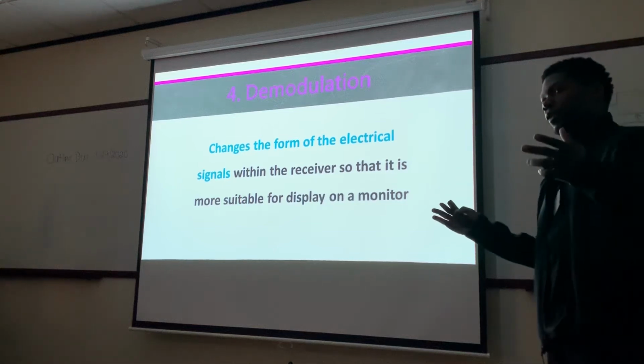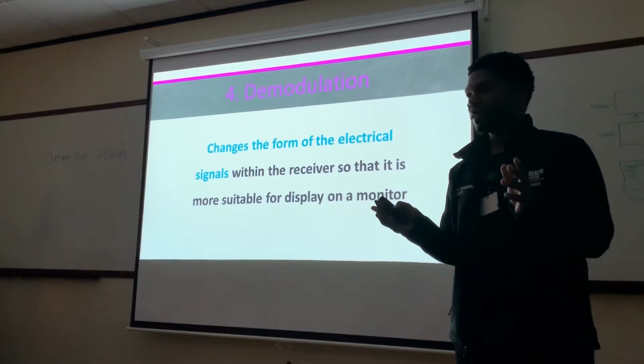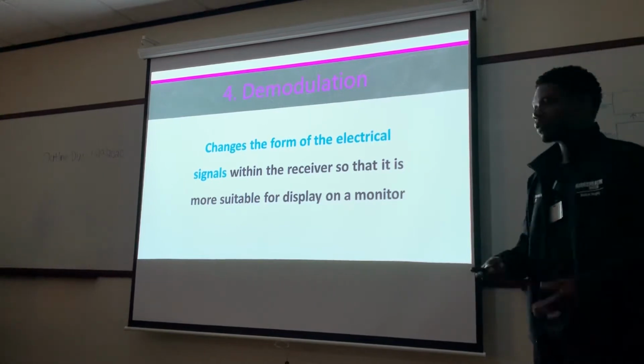There's no correct way in the ultrasound world to cite or label these buttons. There's no correct labeling system, so they're going to label it according to the manufacturer. So that's why it's different depending on what machine you're working on.